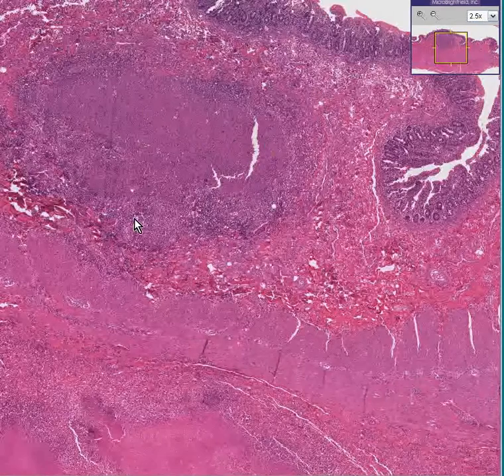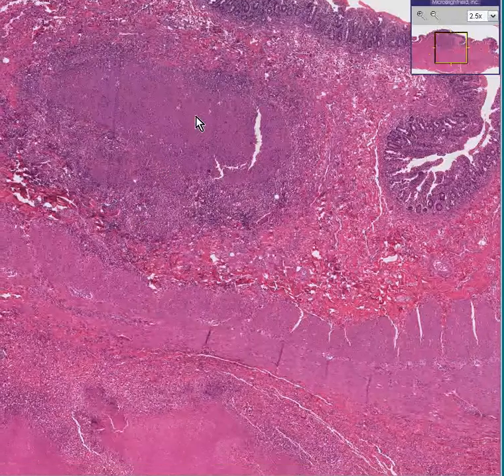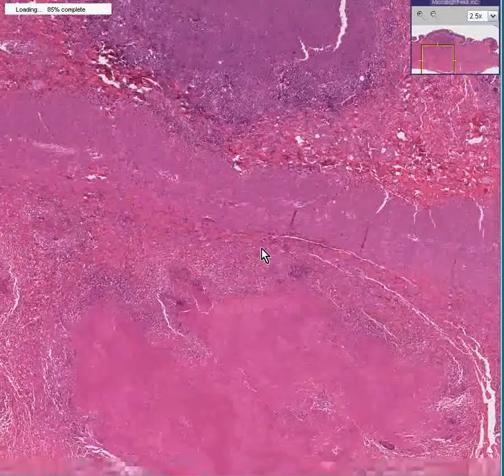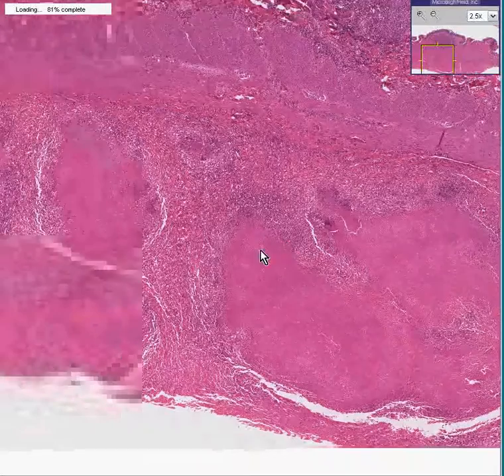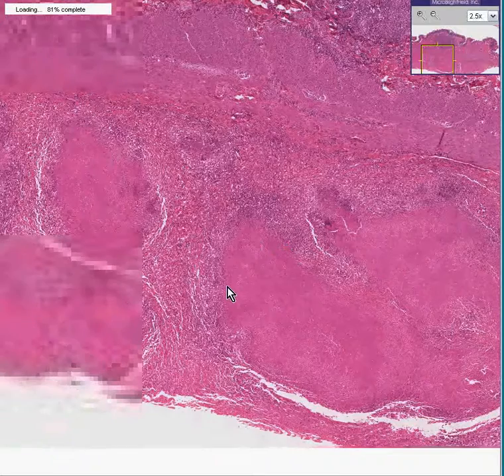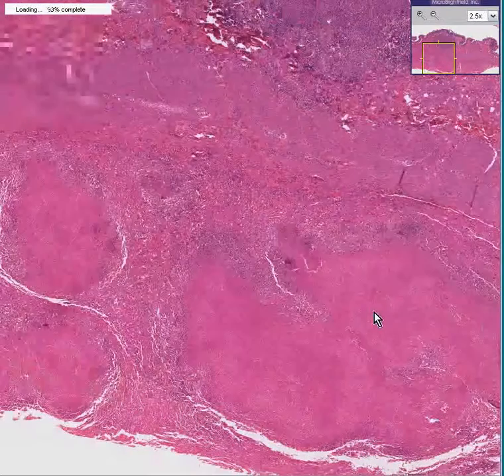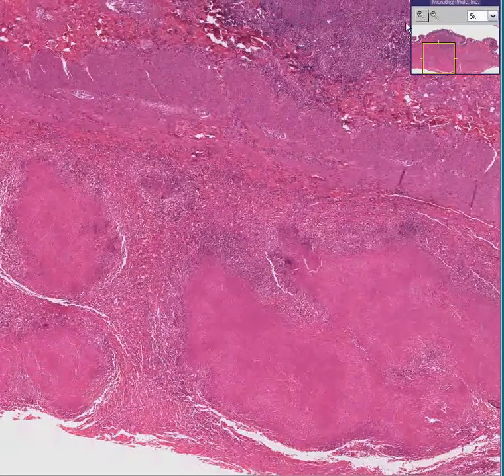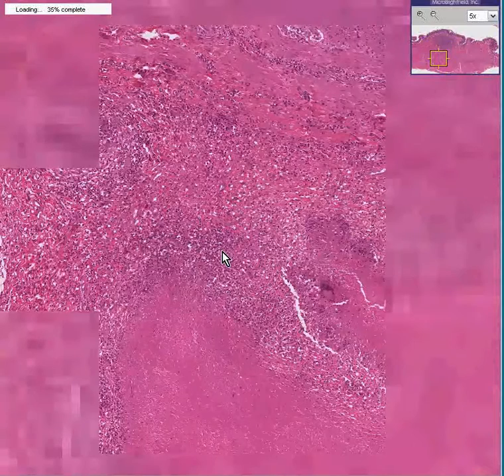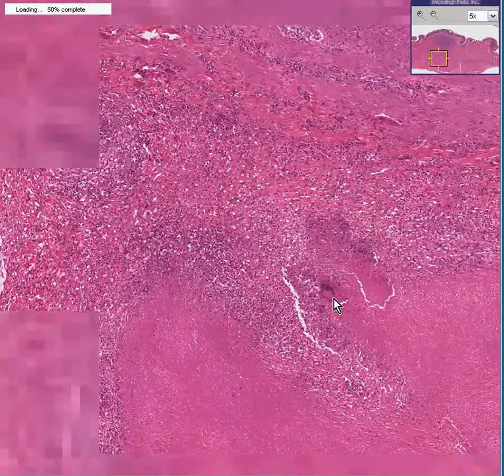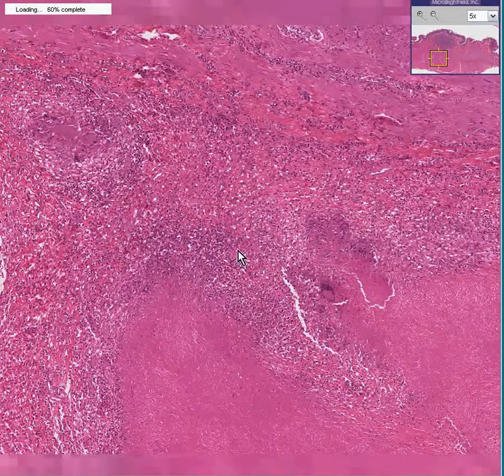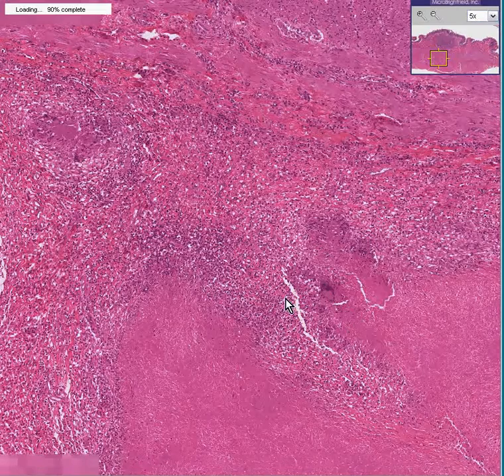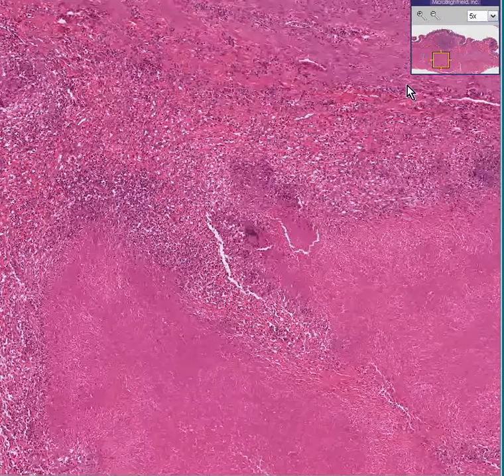If you're entertaining the possibility of granulomas, let's look around the edge of them where you don't see this granular pink necrotic material. You already know they're necrotic granulomas. You can see a giant cell here, and giant cells here. So you already know that these are necrotizing granulomas.